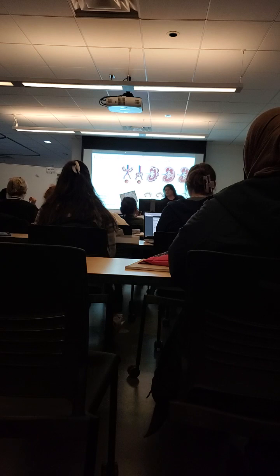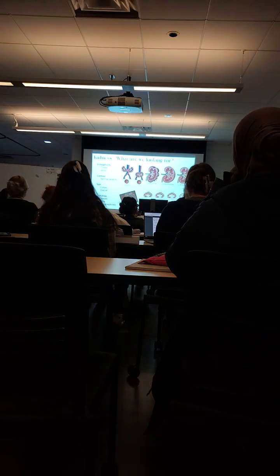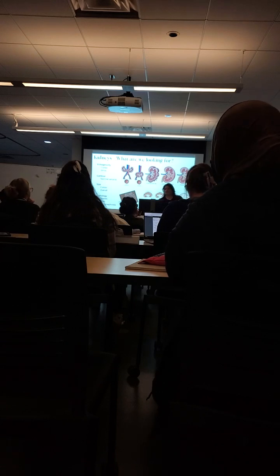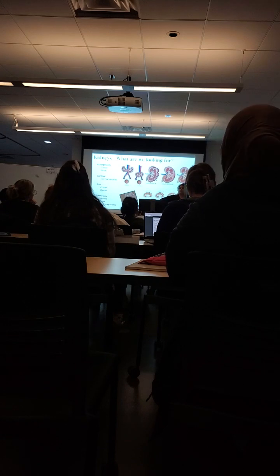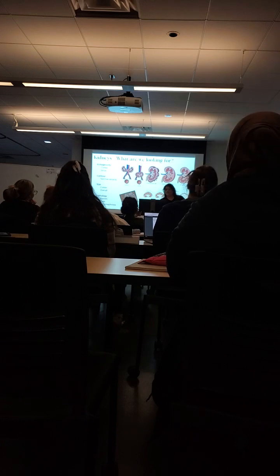Always get good cines. So then there are some things called pancake kidney, where the kidneys, by the way, in a fetus, in a baby, when you're developing, the kidneys start down here, and then they slowly ascend. And not everybody's kidneys actually ascend, right? So this poor baby right here, they just kind of got stuck, so they're lower. So if you're searching for kidneys and you don't find any, start searching everywhere, because they also can have what we call a horseshoe kidney. And a horseshoe kidney is where they kind of separated, but they did it, and now it looks like a horseshoe. And that's all going to be found in the pelvic area.